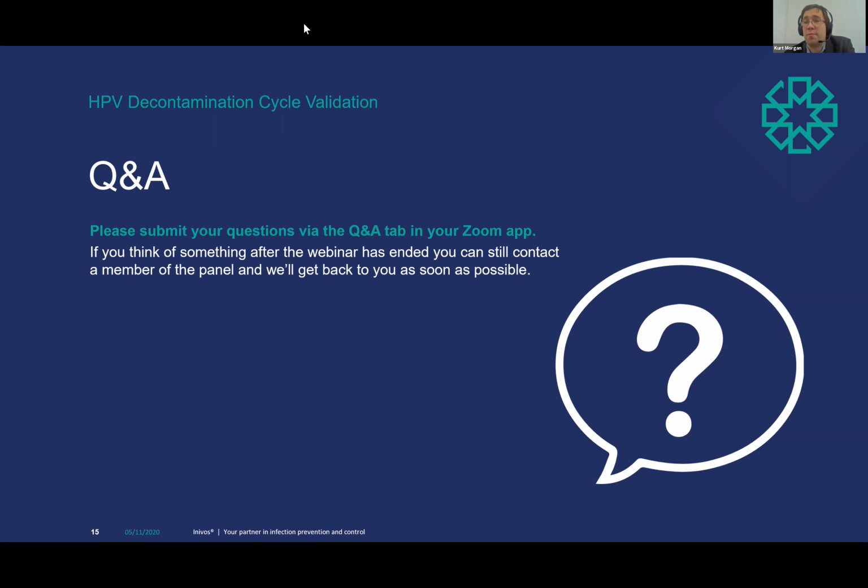I mean, even though I've developed some of the software for this machine, so I can certainly fiddle around under the hood and make them turn on and off when I want to, the server actually validates all of the actual sensor readings. So at the end of the day, I can't do anything that wouldn't be correctly validated in the end. The server will check the readings. I think perhaps this is a comment more about how the machines are controlled in general.